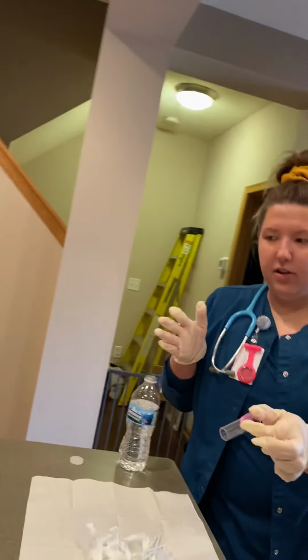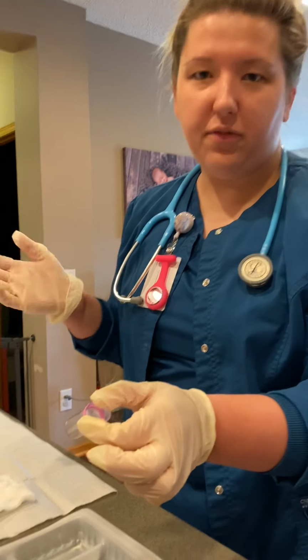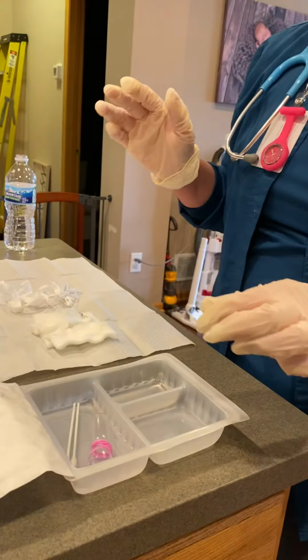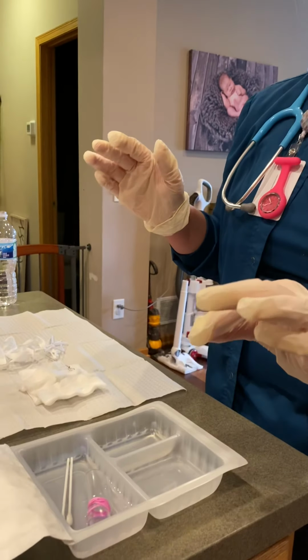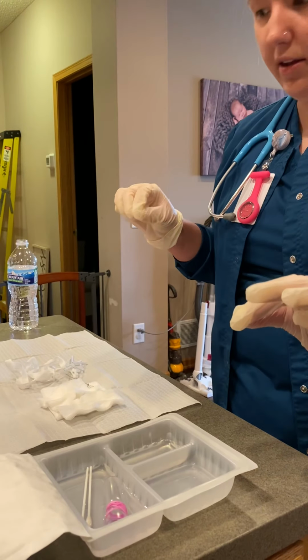So if I would have done that in the clinical setting, I would have obviously wanted to reposition my patient better, but for the sake of the video, I'm gonna drop it in here, and I just wanna make sure I was touching just the top part. And now with my sterile hand, I'm going to grab my brush so I can get it clean.